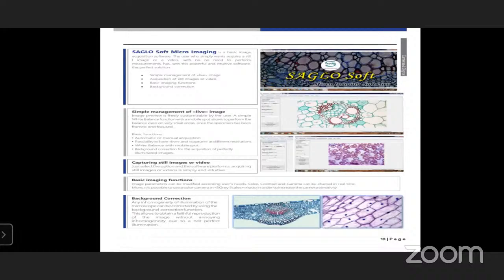And second is for pathology: you can generate the pathological report. For example, if this software is given to any pathologist, they can easily generate their pathological report using this microscopic test. For example, if a patient comes for malaria diagnosis, the blood, when you observe the blood RBCs under the microscope, you can easily see the spot of the malarial parasite present in those cells.